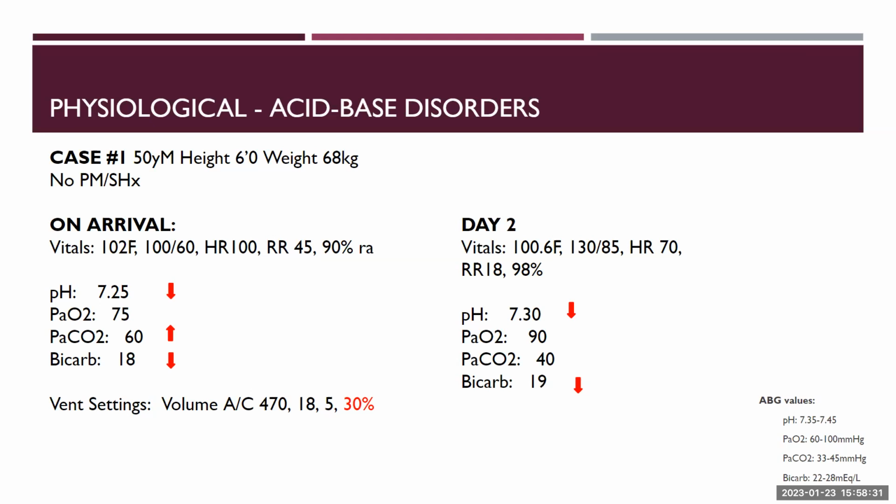We can start with the basics. His temperature seems like it's going down, and his heart rate looks a little more stable. Respiratory rate looks better. I would say the respiratory compensation looks a lot better. It's not perfect, but I think you could potentially try taking him off the vent. It seems like things are improving.